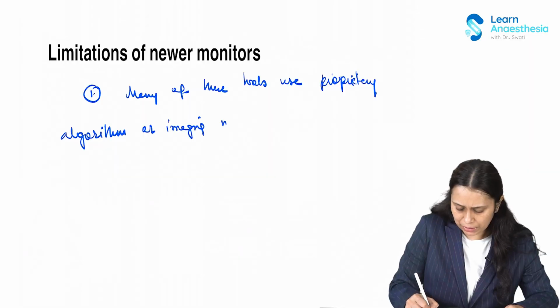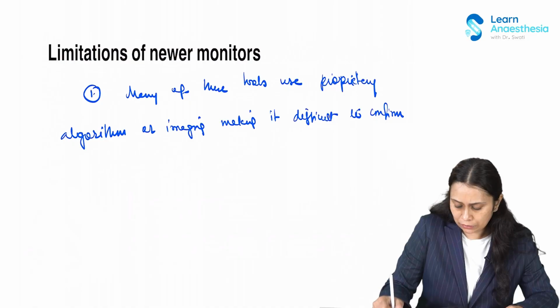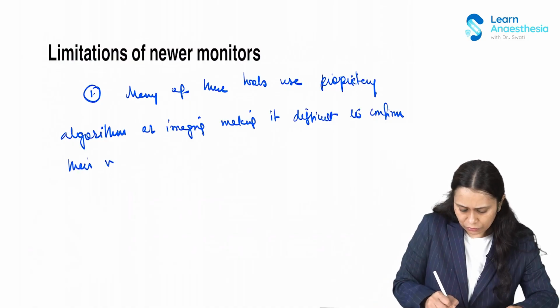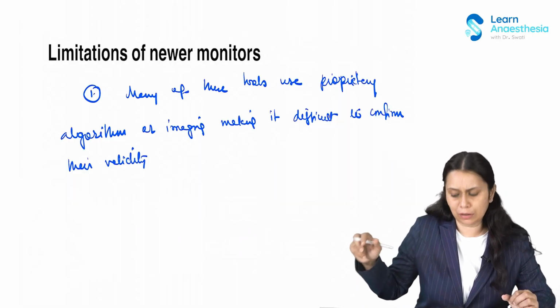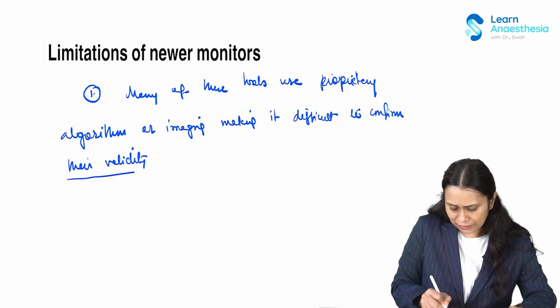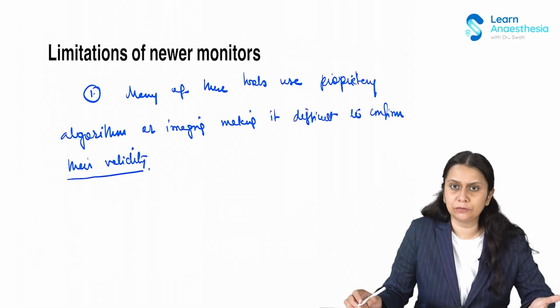These algorithms are company based, and they vary from one company to another. So their validity, for most of them, is still not confirmed by large RCT trials, etc.